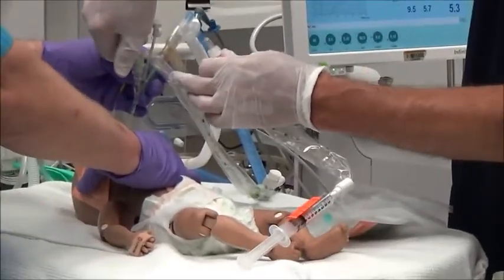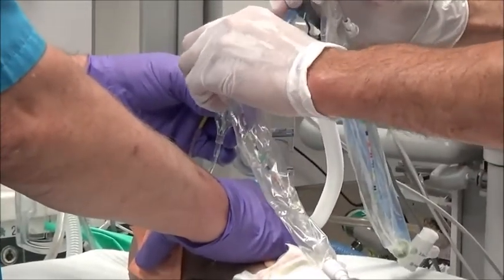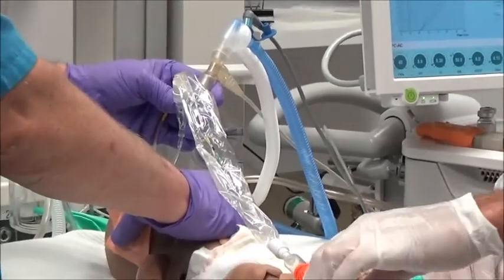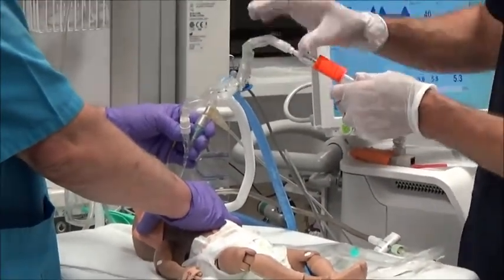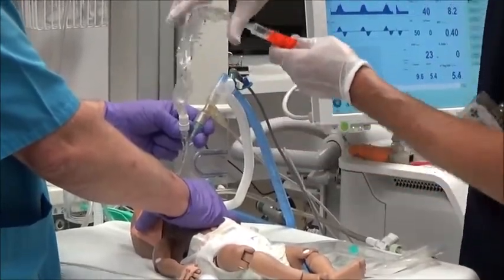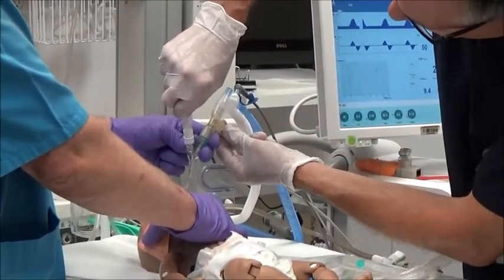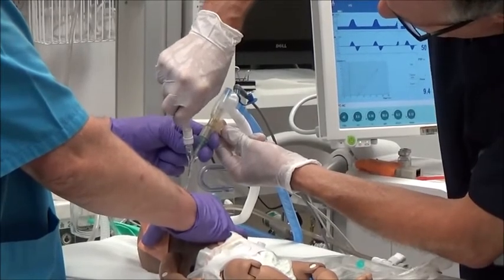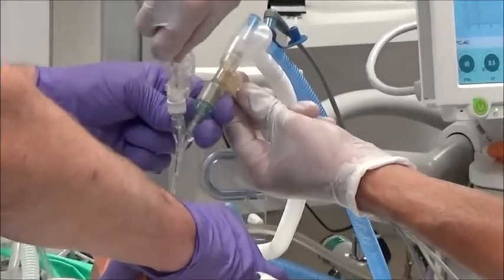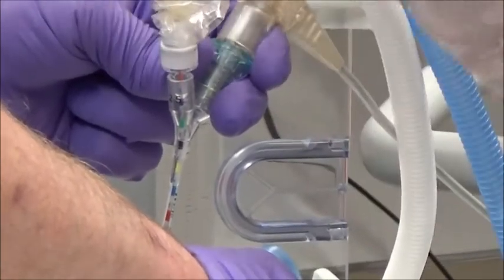Replace the suction catheter with the MAC catheter into the endotracheal Y adapter. Determine the desired depth of insertion by locating the markings on the catheter and endotracheal tube. The catheter end should line up slightly higher than the distal end of the endotracheal tube. Advance the MAC to the appropriate depth — the number on the MAC should sit just above the corresponding number on the endotracheal tube.